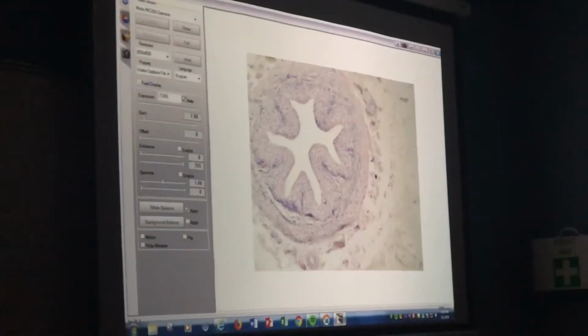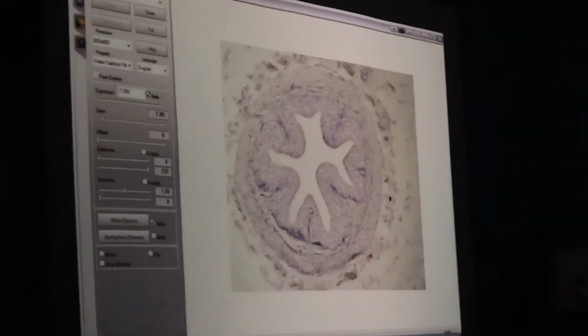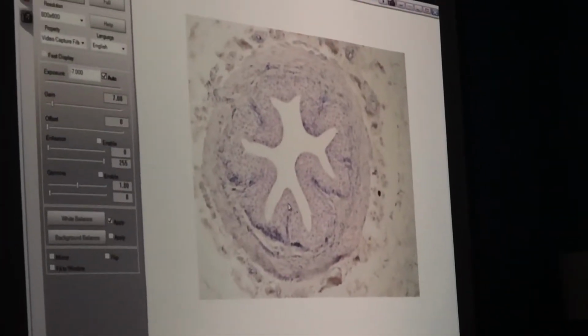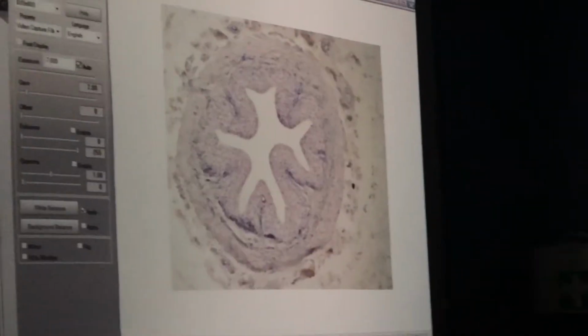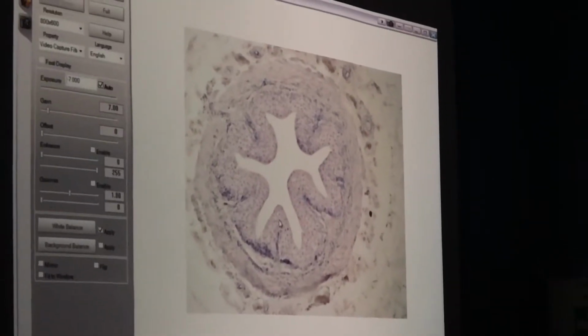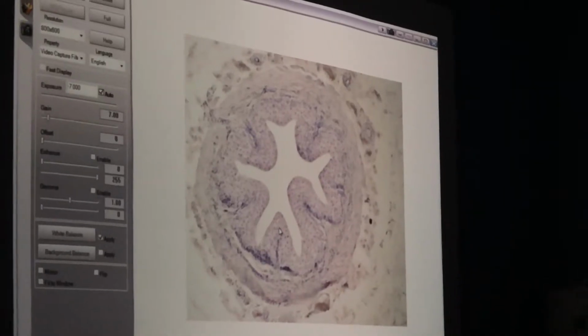Okay. Ways to differentiate one tube from another. All right? So in the urinary system, we really just have one tube. How are you going to tell this tube from all the rest of them? Transitional epithelium, absolutely. So none of the rest of the tube should have transitional epithelium.